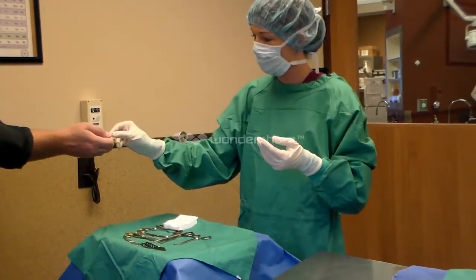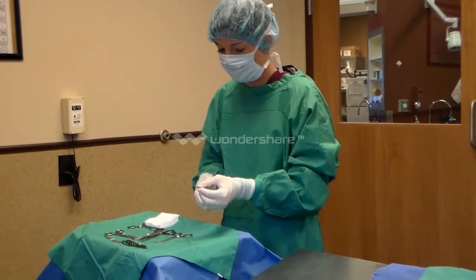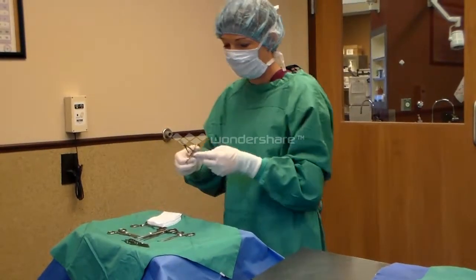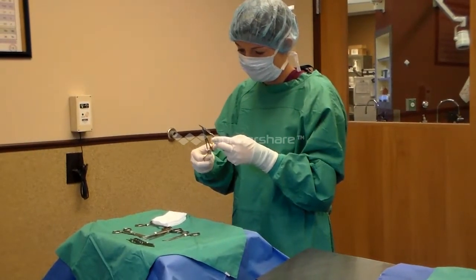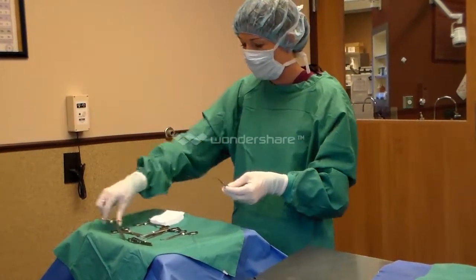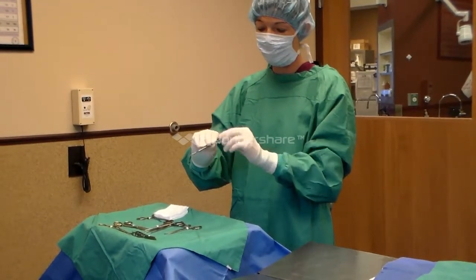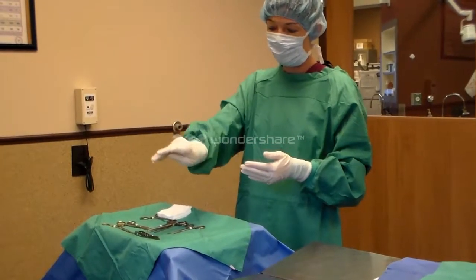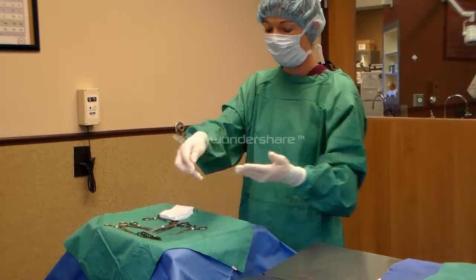Ready for our blade. We're using our needle holders. Place this blade on the handle. I'm going to make sure it's on there completely. If we were going to pass this blade to a doctor, it's important to remember that the cutting edge of the blade be turned away from both my hand and his hand, and I'll place this in his hand just like this and hold it there firmly to make sure that he has hold of it.